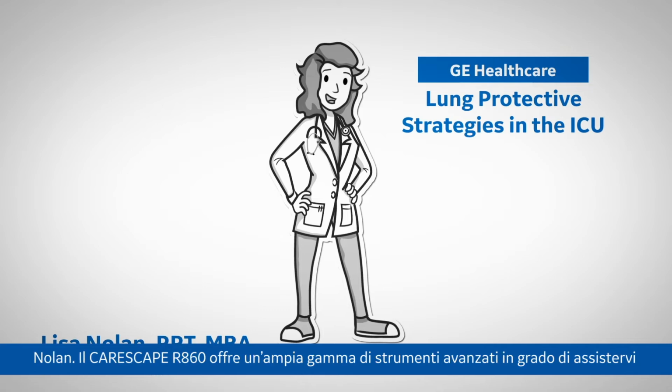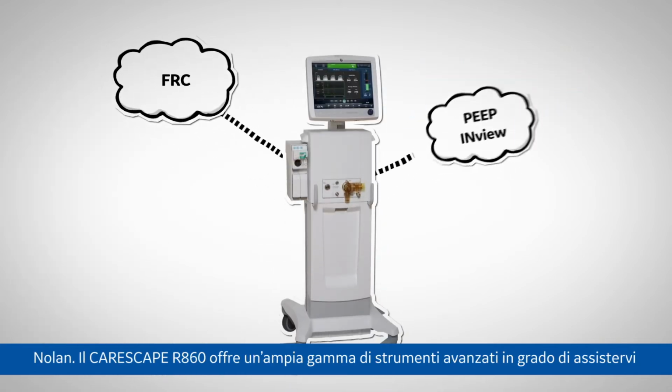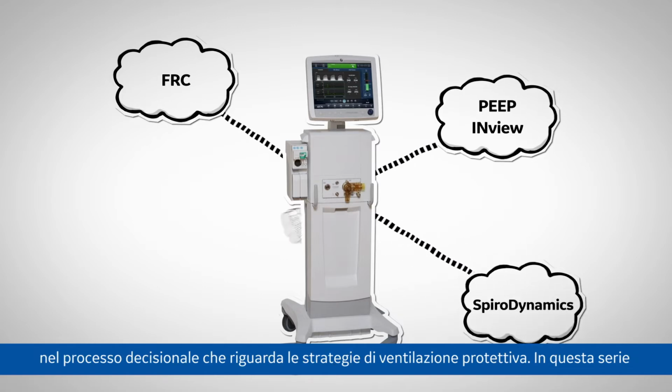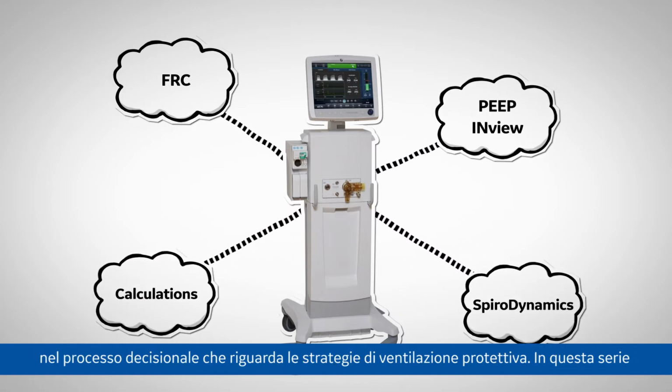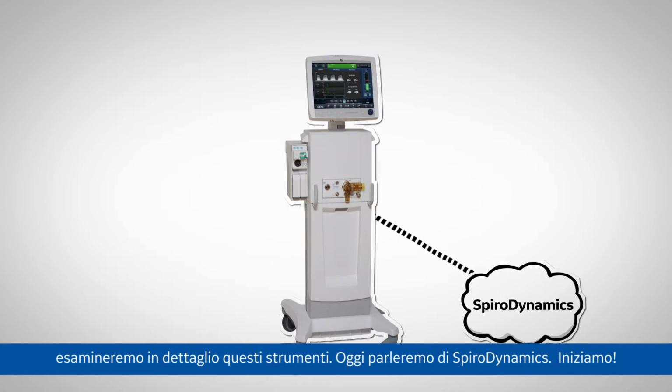I'm Lisa Nolan. The CARESCAPE R860 offers a wide array of advanced ventilation tools to help with the clinical decision-making process around lung protective strategies. Throughout this series, we will discuss these tools in more detail. Today, we will discuss Spiro Dynamics.